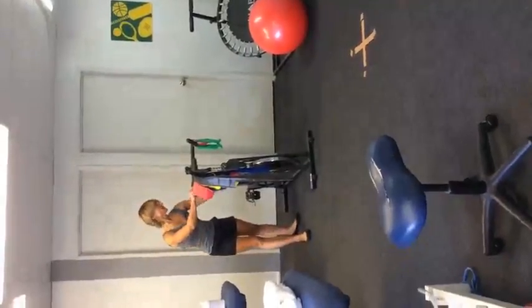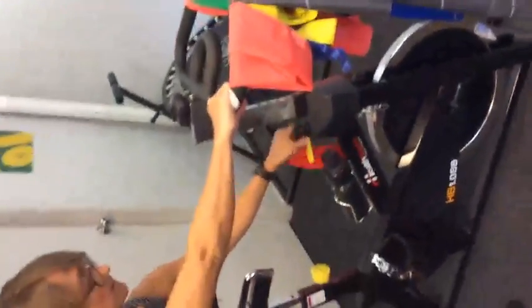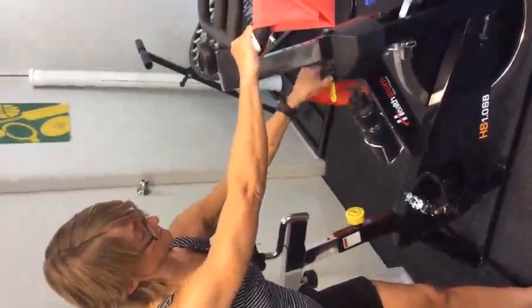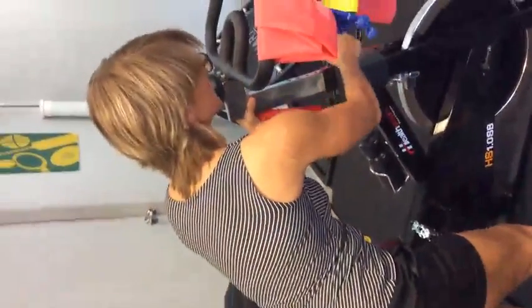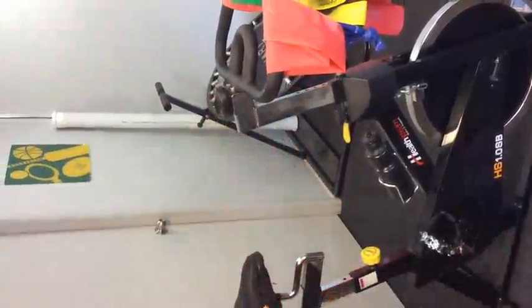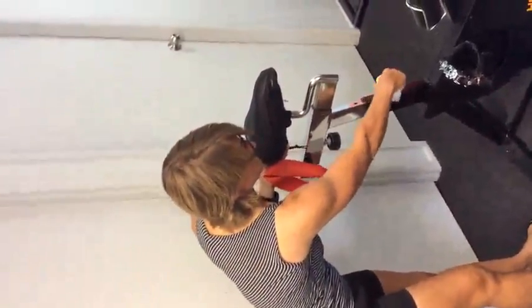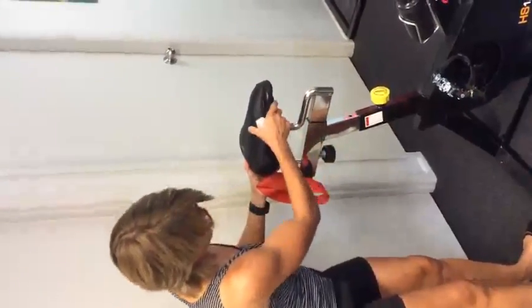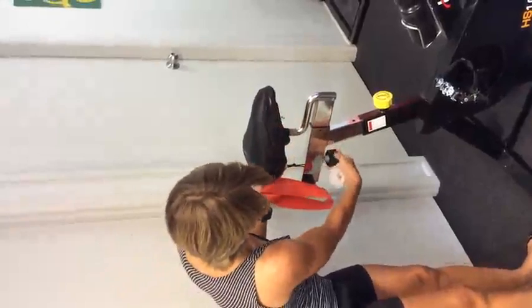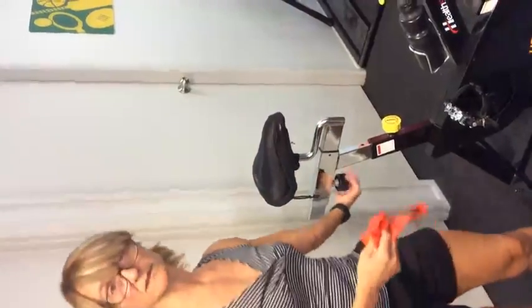To adjust the bike, we just use these levers. We can adjust here — this adjusts the height, and then you push or pull to the height that suits your client. This adjusts the seat, and you can push, pull, and slide the seat and tighten it with this knob here.